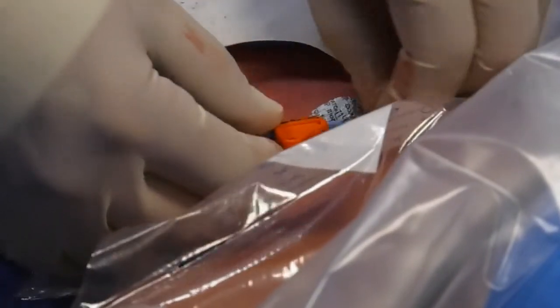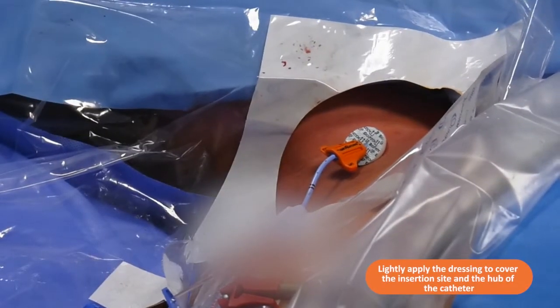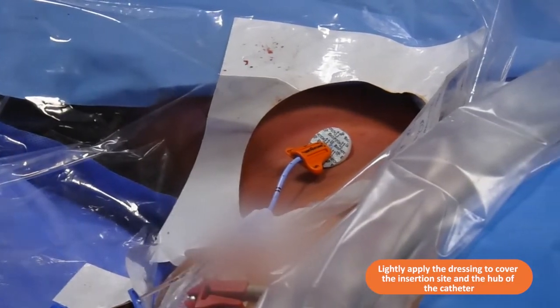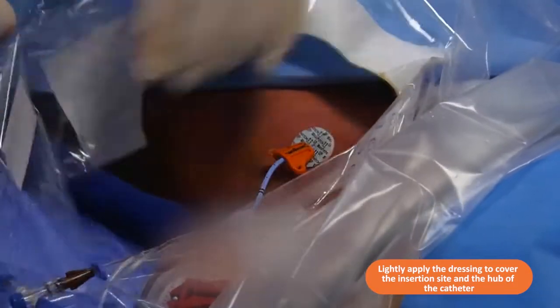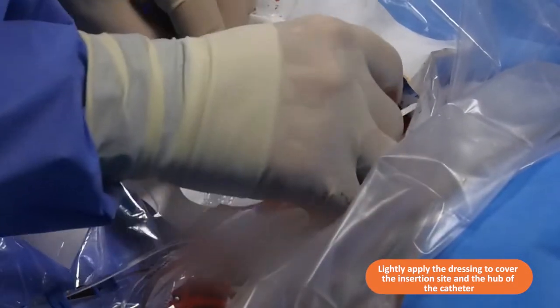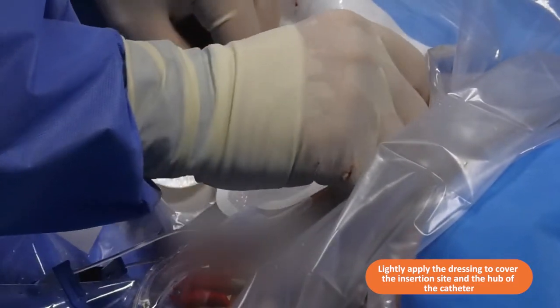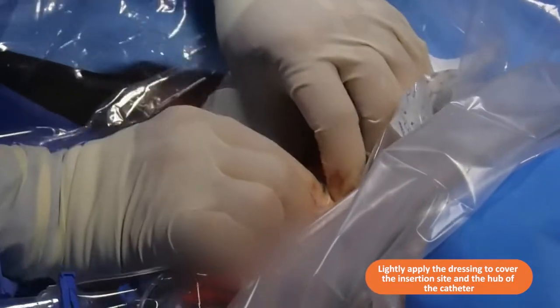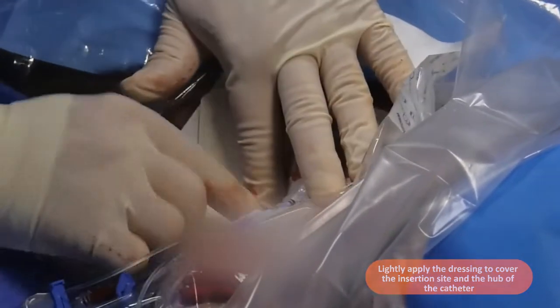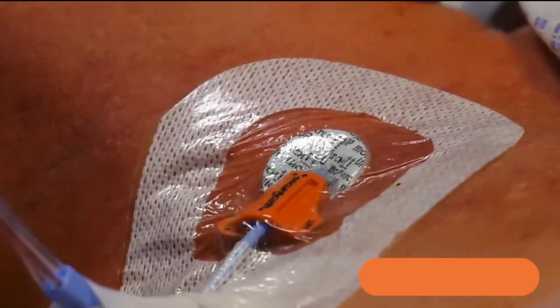As part of our infection prevention procedure on this unit, we're using a biopatch chlorhexidine-impregnated sponge. We're fitting that around the insertion site and laying it down. All that remains is to apply a Tegaderm advance CVC dressing, which goes over the hole. Ask the patient to look to the left to take as much tension off the line as possible, then make sure the dressing is bonded down and sealed all the way around.